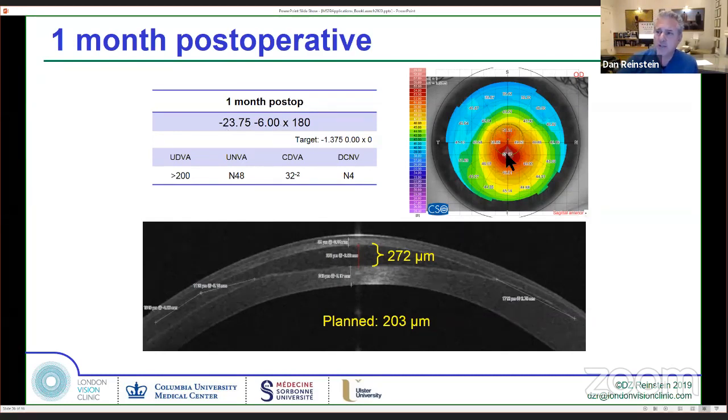This is why his cornea is steeper, because I've got a lot of edematous lenticule which is not deturgescing in the middle of his interface, probably because he has separated stroma and this tissue is just sitting in the middle, and there isn't enough oncotic pressure or a vacuum, as you like, to suck out the water of the lenticule, because there is an interface that is not communicating adequately for deturgescence. There's no tension in this lenticule. It's just sitting there, a little piece of tissue in the middle of the cornea.